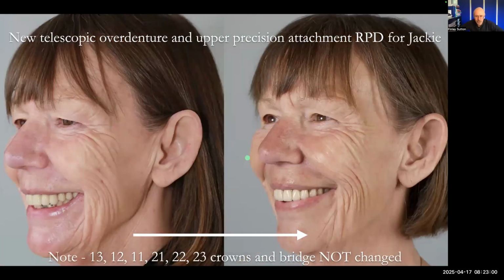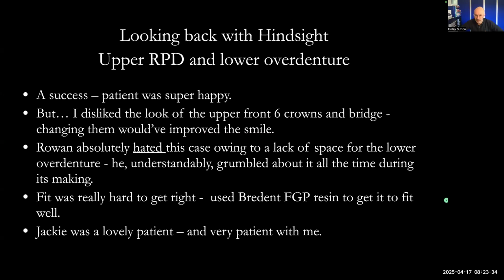It worked out really well. She lives really locally to me. So this was finished in 2021 and it's been functioning really well since then. So we're 4 years down the line. Interestingly, she'd only had 6 years of service from it when it had been done originally. So the point I think is really important is that these things are really expensive when they're done in the first instance, and they're really expensive to fix.